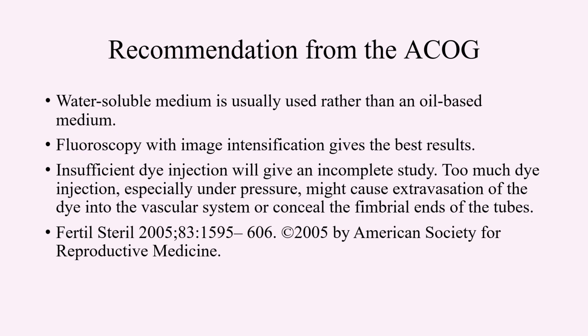This recommendation from ACOG was published in 2005 in the journal Fertility and Sterility and can be accessed for further information. If you want to see more images of hysterosalpingography, I recommend that you go to this publication in 2005, where a very large number of images are given with hysterosalpingogram.